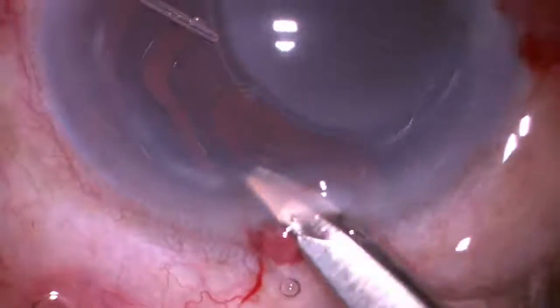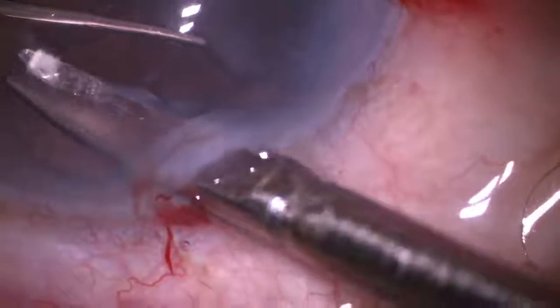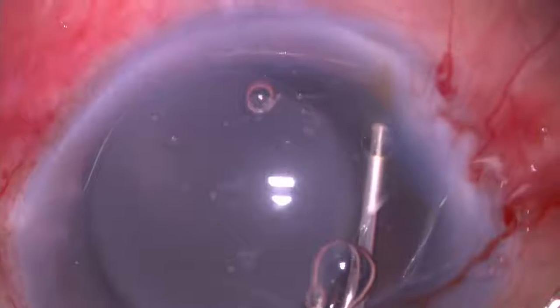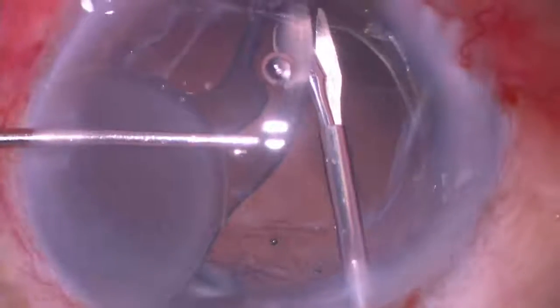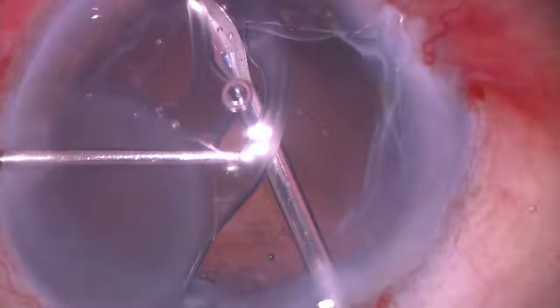In order to retain a capsular support, haptics were cut, leaving behind the fibrosed ends. Inferior haptic was accessed through the side port and was cut with micro scissors.